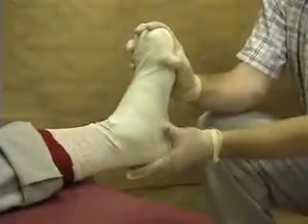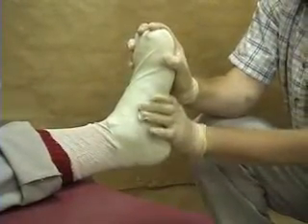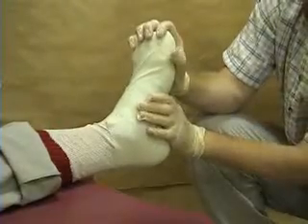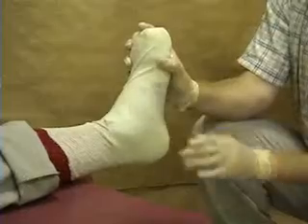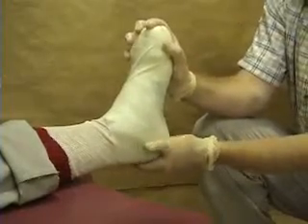Now I'm just going to support the subject's foot now so he can relax, and we'll just again make sure that those toes are straight and the ankle is at 90 degrees. This will take about 10 minutes to set.